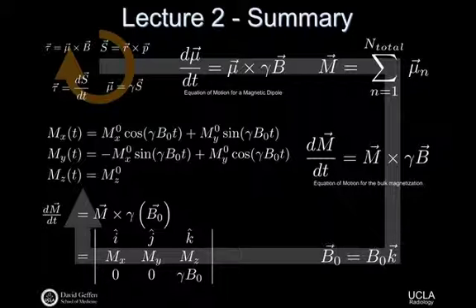And then under these conditions, at least, laboratory frame, no relaxation, the Mz component of the magnetization is just a constant. We have some mythical, magical condition where the state of the magnetization is such that it ends up tipped over. And under these kind of arbitrary conditions, it will just stay with that component of the Mz magnetization forever, right? It's not a real situation, but it's a useful mathematical example.